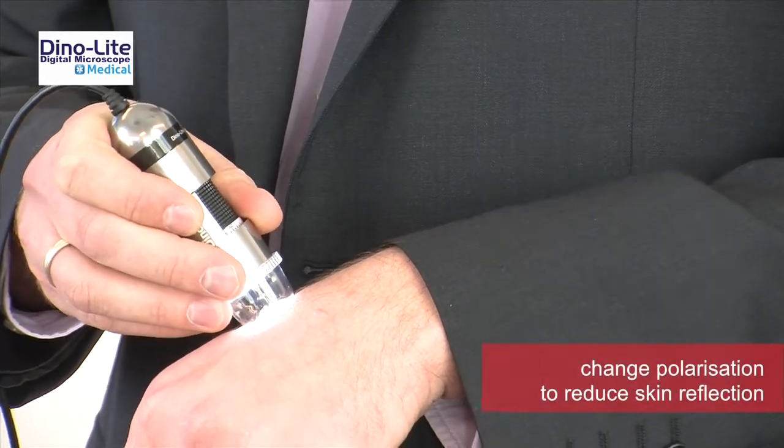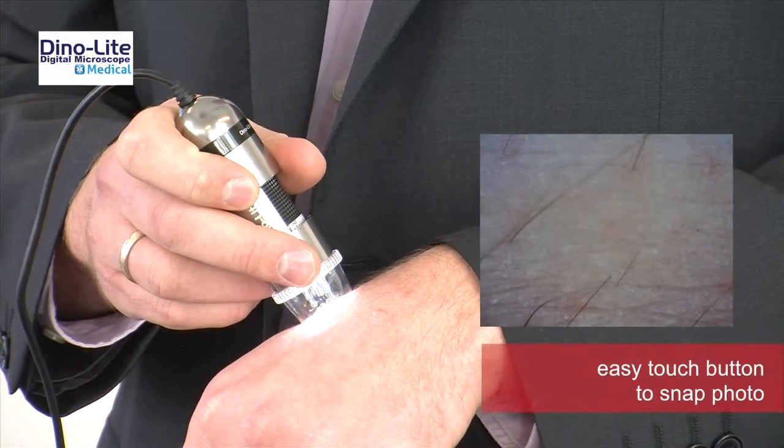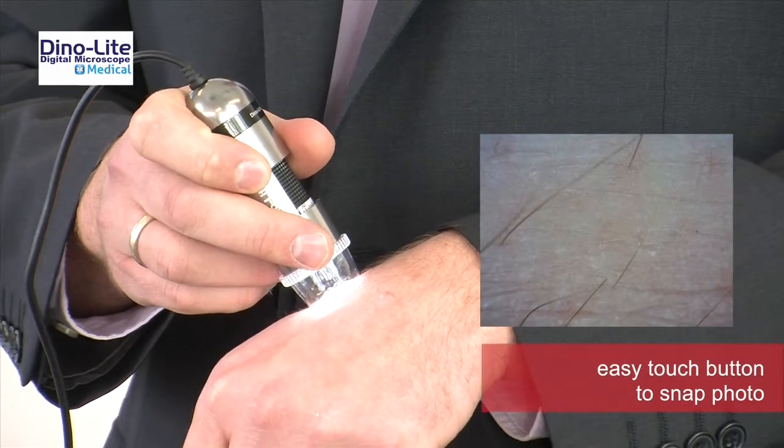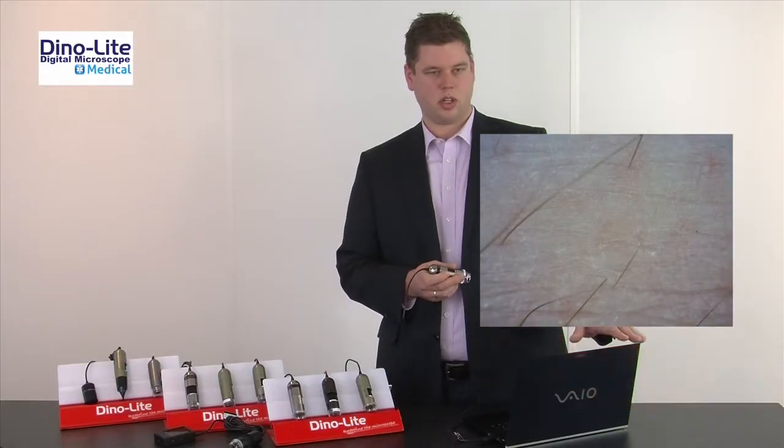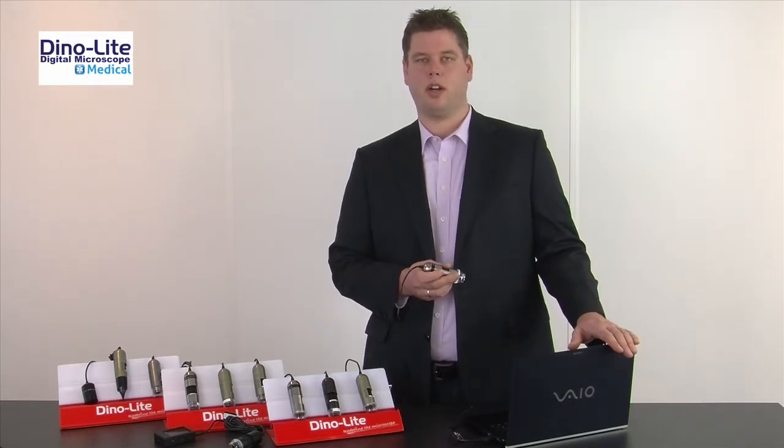I can change the built-in polarizer to reduce the reflection on the skin and make an image all with one hand. The image is being stored in the computer and can be linked to the patient, offering comparison options.